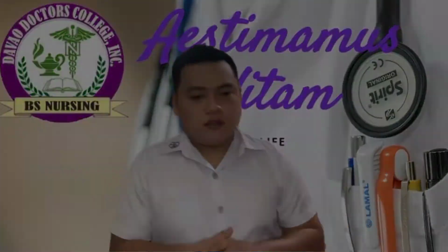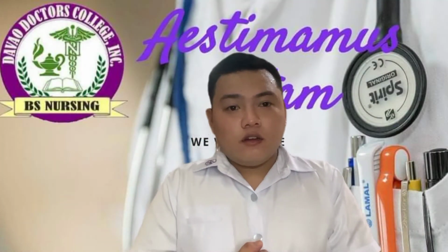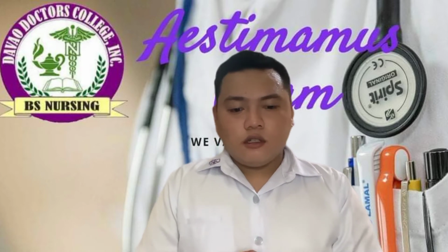So to start, let me show you the materials that we'll be needing for first aid rigid board splinting. So first material that will be needed is rigid board. This is our rigid board. Or if not available, you can use a flat carton that can support the broken arm of the patient. Next you need a triangular bandage. If you do not have a triangular bandage, you can use any cloth or long handkerchief that can serve the purpose. Also, lastly, the gloves. So first procedure, prepare necessary equipment like rigid board, triangular bandages, and at least 2 or any cloth that can serve the purpose.